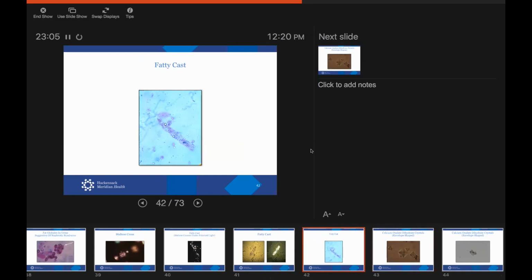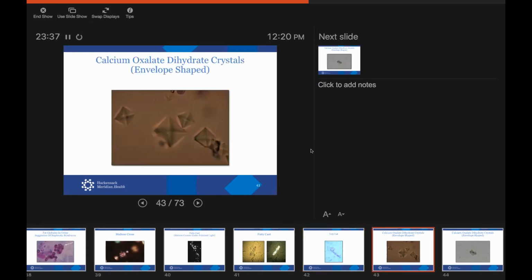Okay. So now fatty casts. If you see fat in the urine, you now have to know diseases that will typically present with nephrotic syndrome: membranous, FSGS, minimal change disease, patients with far advanced diabetes. You have to have nephrotic range proteinuria. So usually diseases like even ANCA vasculitis, you don't usually see fatty casts. They present with a proliferative sediment, usually 2 to 3 grams, but not nephrotic range type proteinuria. Okay, so you see other things.